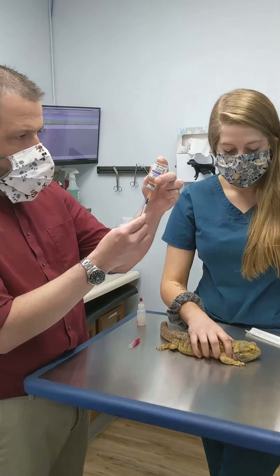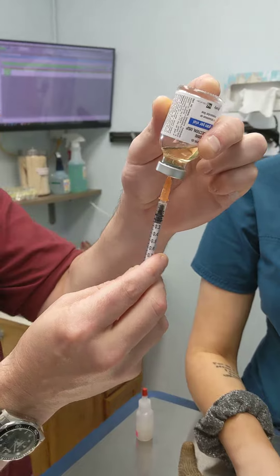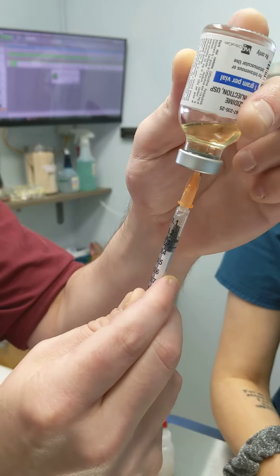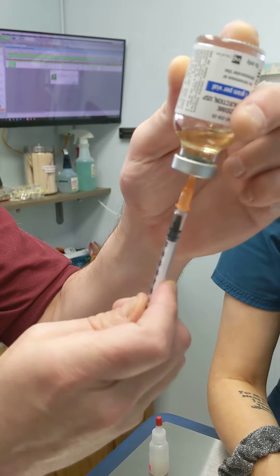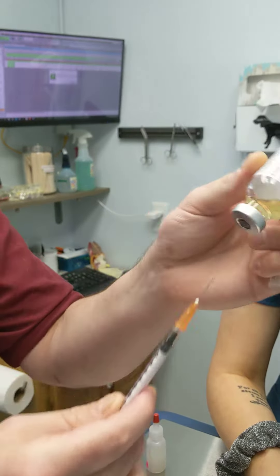If you look closely here, our friend is getting .15, so we're just going to draw it up to here. I'll draw up extra — you'll see there's a little bubble — and then I'll push back so we get the air out of there, up to what I need. So I've got my .15.